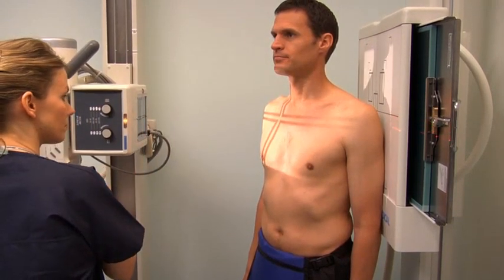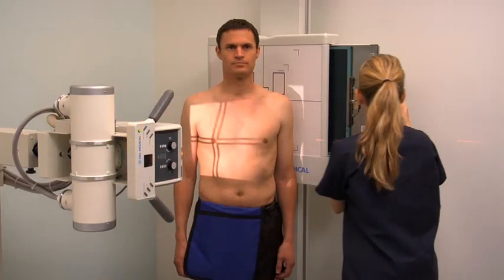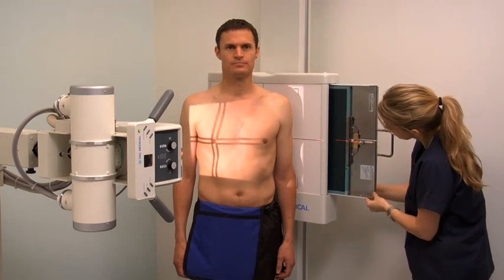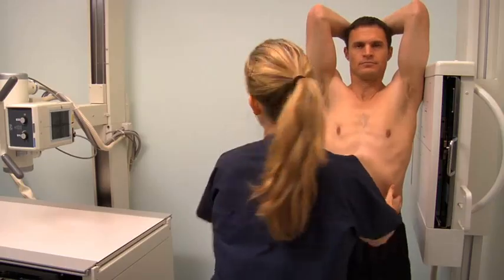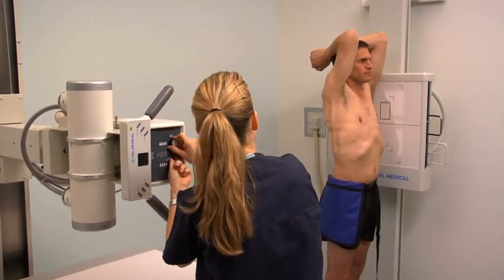It is a projection in which the central ray enters the body or body part at an angle following an oblique plane, while the central ray remains perpendicular to the IR. A lateral projection is one in which the X-ray beam enters on one side of the body or body part and exits on the opposite side.